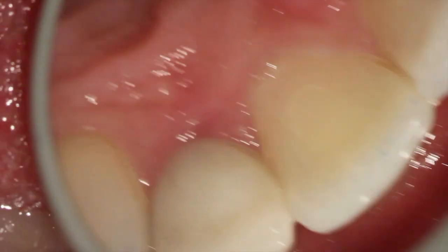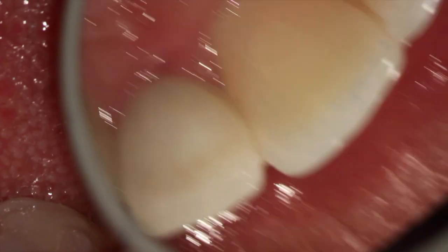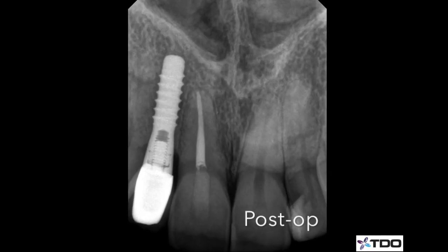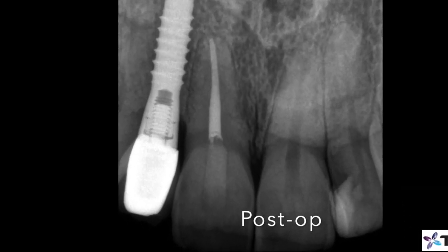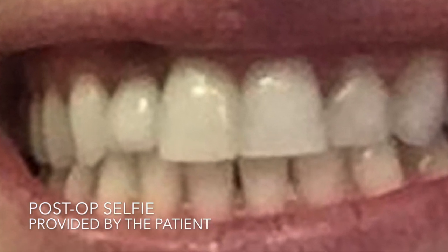It's typically all done under the microscope again, and it looked really nice — she was happy with the result. You can see in the x-ray that re-treatment wasn't done, no new crown — just a new restoration after the bleach. She sent us this picture afterwards as well.